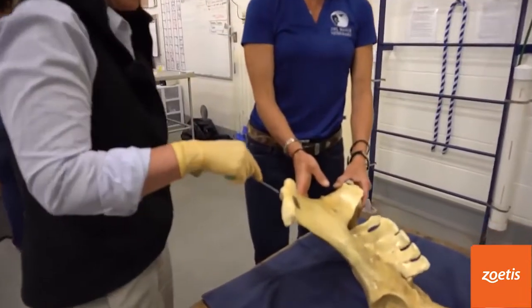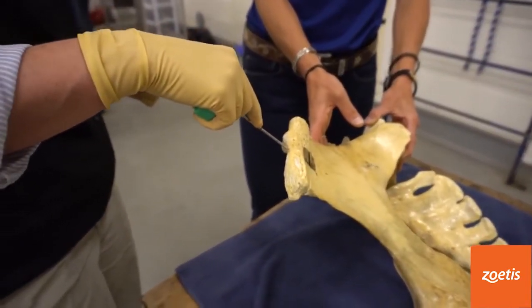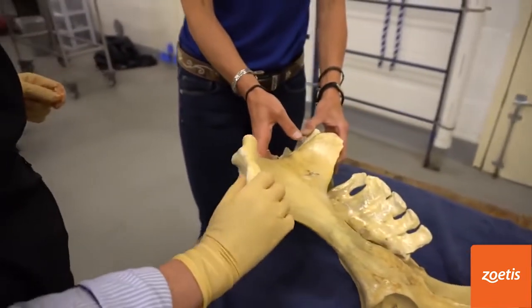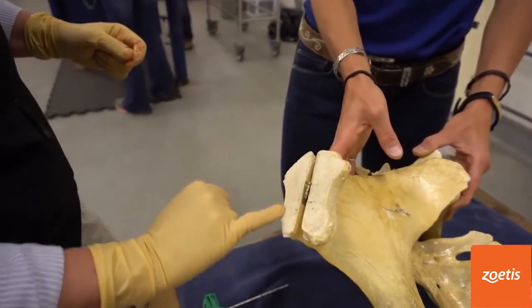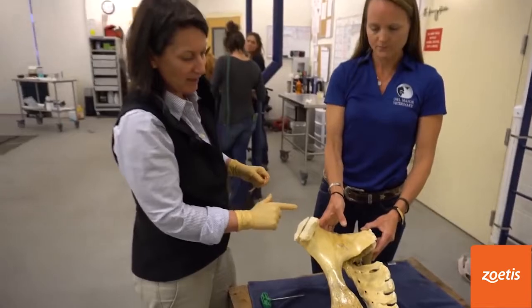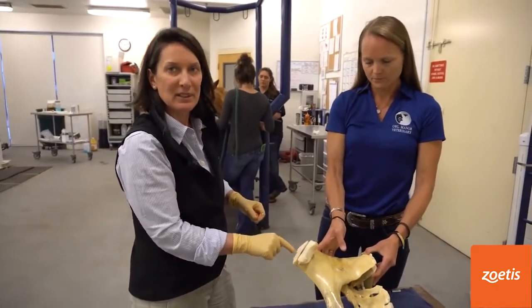That's right where we're going — right in here into the mid body of the ilium, and again we're going to go in about two centimeters. Right here is where our marrow space is, so right in here is where our marrow sits. This is obviously a cadaver, but this is where our marrow is sitting and that's where we're going to collect it from the ilium.